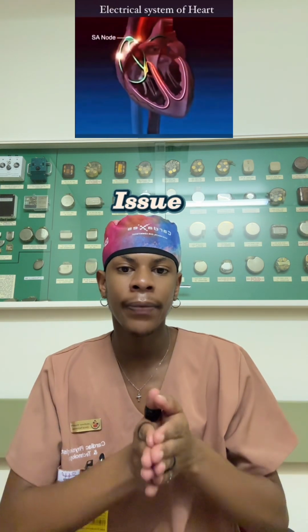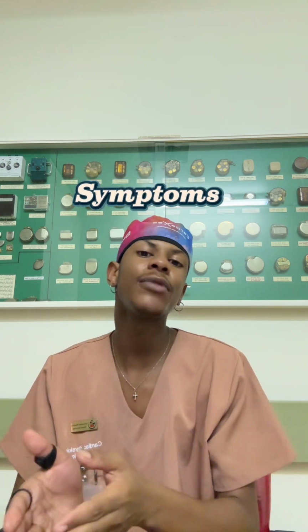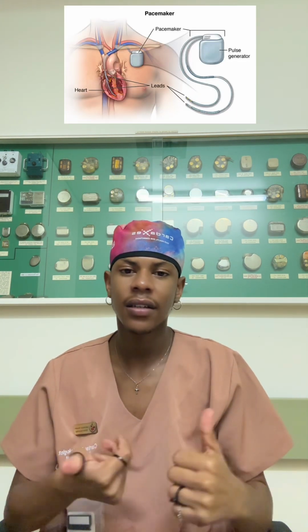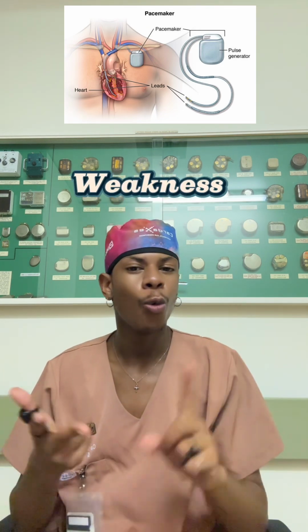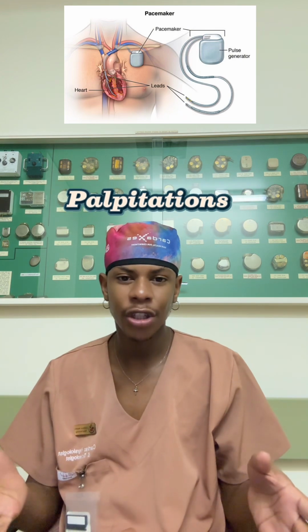So if a patient has an issue in their conduction system resulting in their heart not contracting well, we usually implant pacemakers. Some symptoms that patients usually experience include dizziness, fatigue, weakness, syncope, and palpitations.